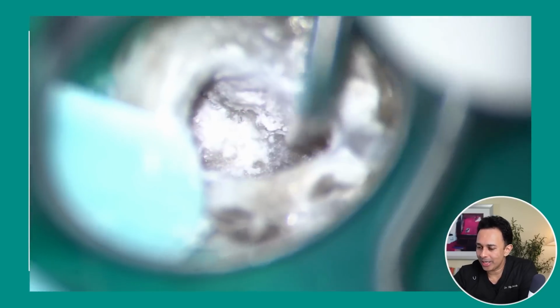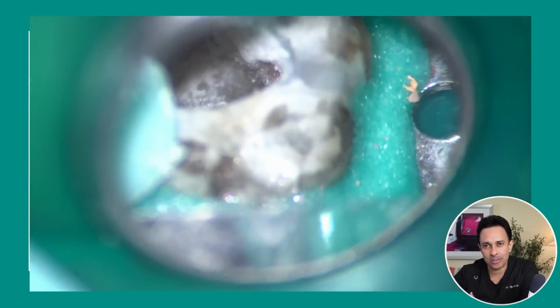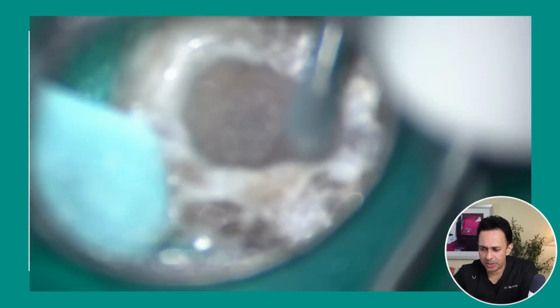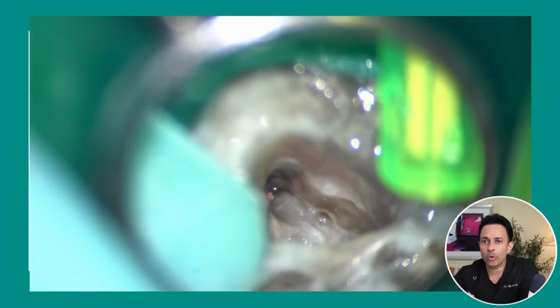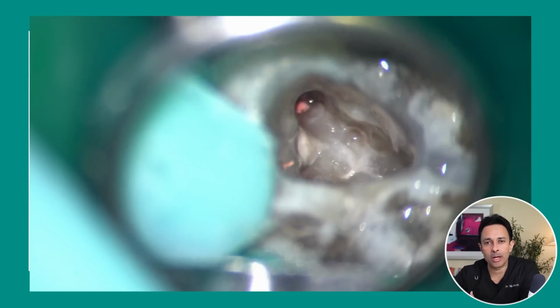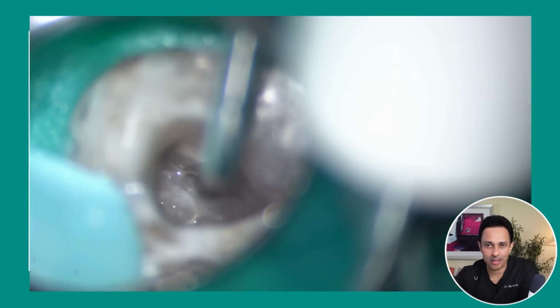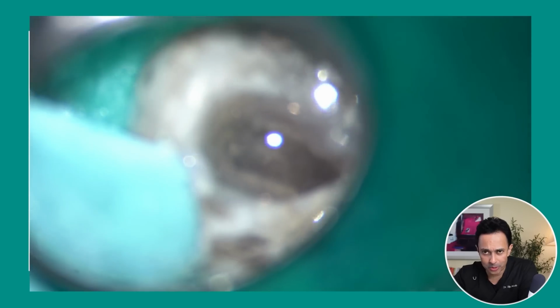And then once you cut dry, then you can alternate this with ultrasonics in a wet mode. So use ultrasonics with water to just flush out all the debris. So you can alternate with a needle burr mounted on an electric handpiece or an air-driven handpiece, but cut dry, and then follow it up with an ultrasonic in a wet mode to flush out all the debris.